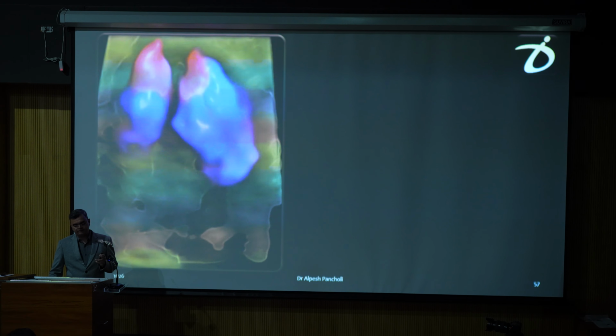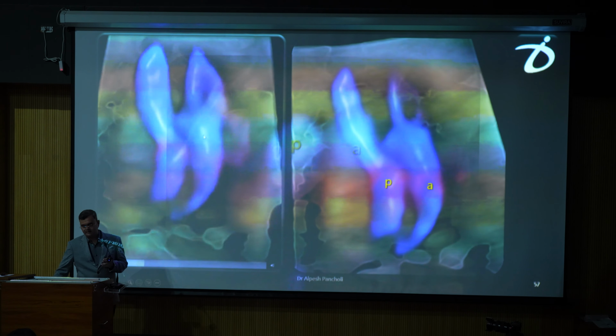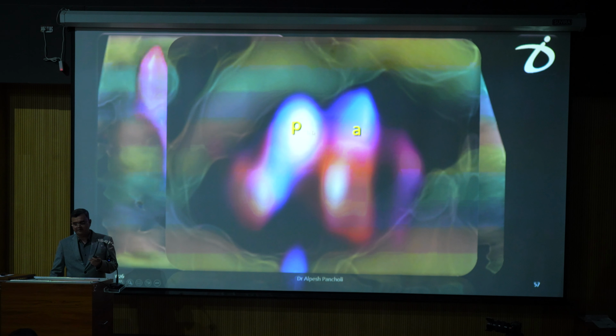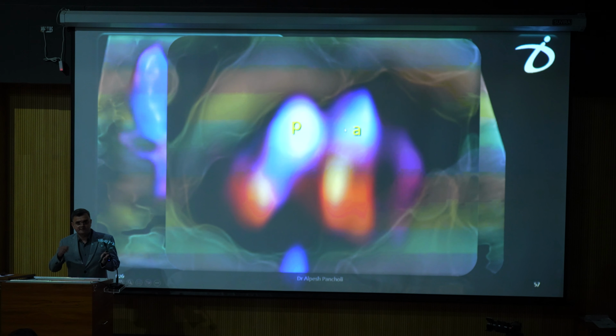And in the sweep we can see the parallel outflow tracts, and on the en-face view of the valves we can see the pulmonary valve and the aorta lying side by side. So this is a subset called side-by-side TGA.